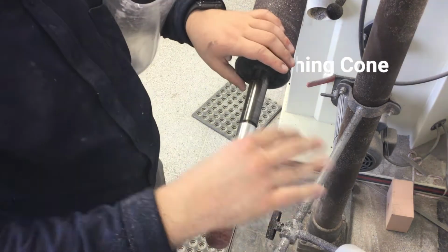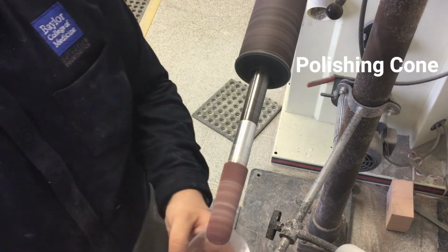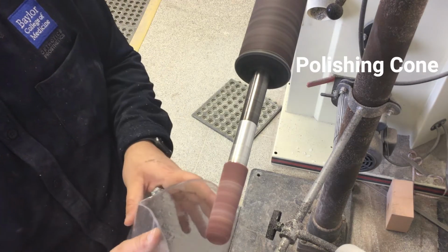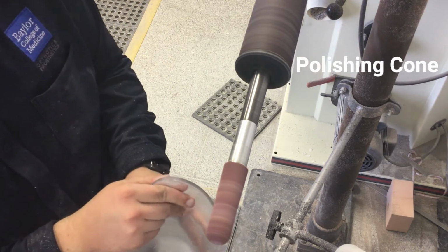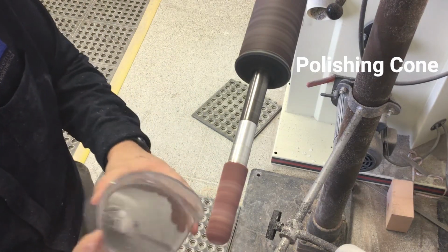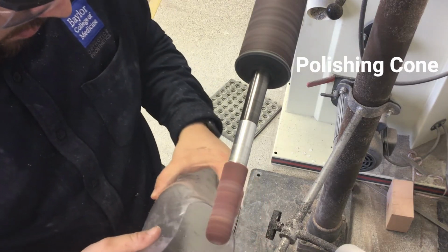Lastly, we'll use the polishing cone to smooth out the contour transition along the trim lines of the socket. We will want to do long, gentle passes along the trim lines using that same pulling motion to ensure to keep the shape and transition we just worked on.